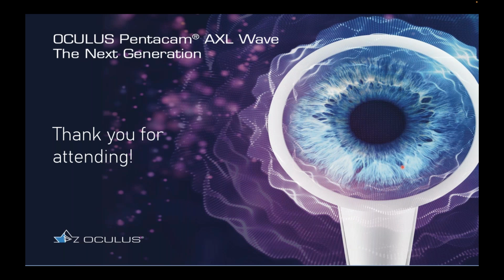And not only that, one of the other nice things that we'll be able to do more of, and we can already do a little bit, is decentering the optic zone in our lens. So if our lens does ride low a little bit, or ride high or whatever, decenter in a direction, we can always move that optic zone a 0.5 millimeter or something like that. Not a lot, but enough to maybe get rid of some of the visual issues and just create a more uniform fit too.